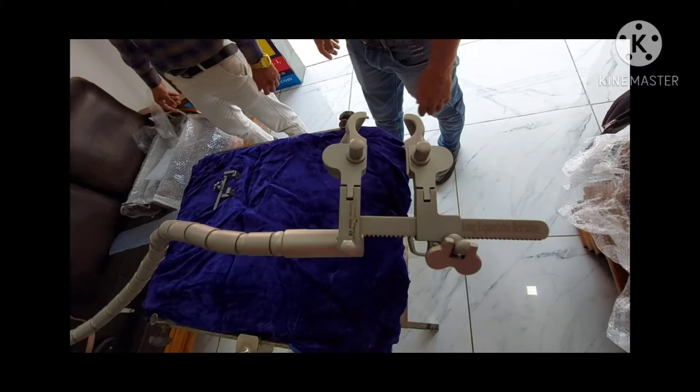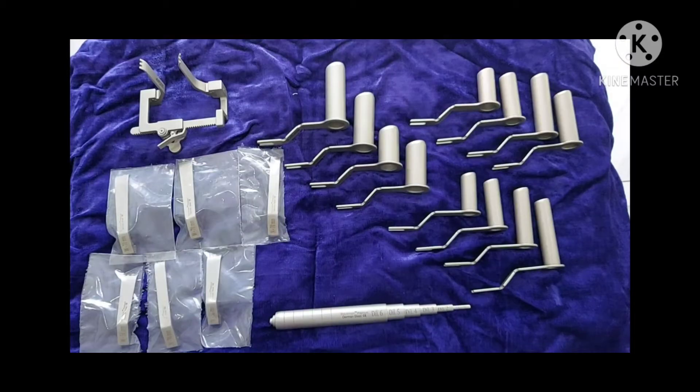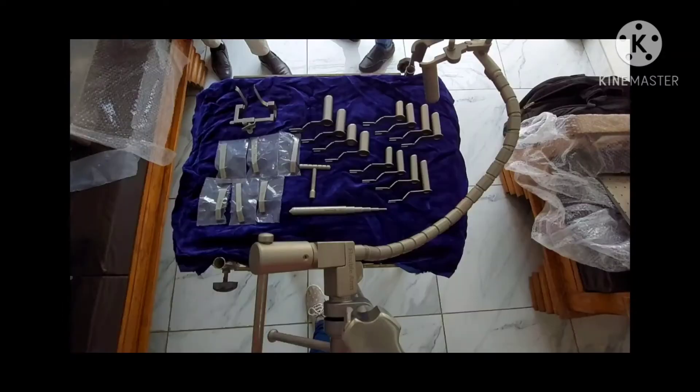Now let's talk a little bit about the tubular retractor. The advantage of the tubular retractor is that through 1 inch of incision we can remove a disc, and through 2 inches of incision we can remove a spine tumour and put 4 screws in the spine to stabilise it. Longitudinal and medial lateral retractors can increase the area of surgery and can be used for single side lateral fixation and small spinal tumours.